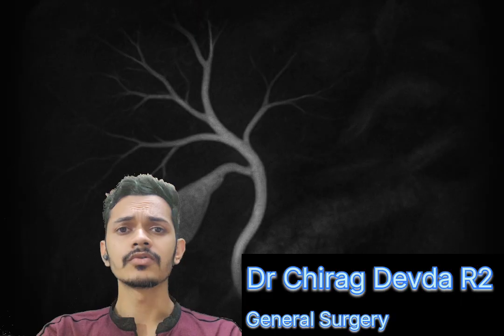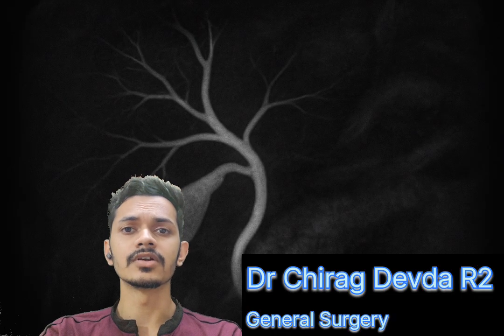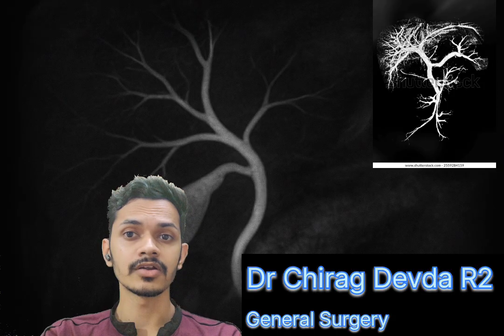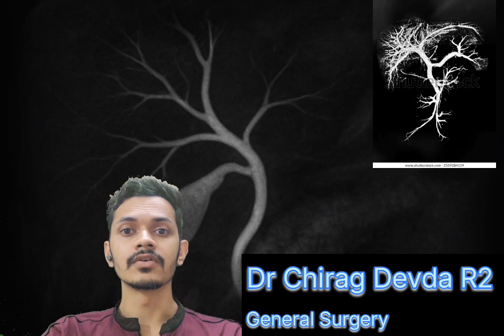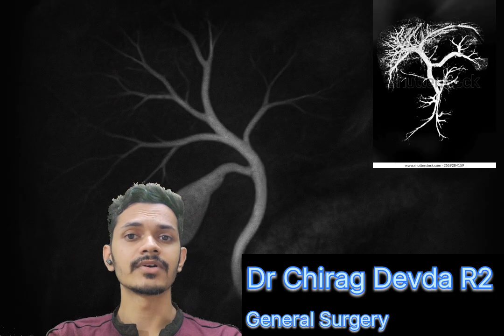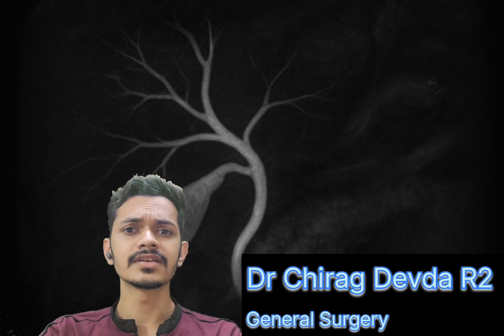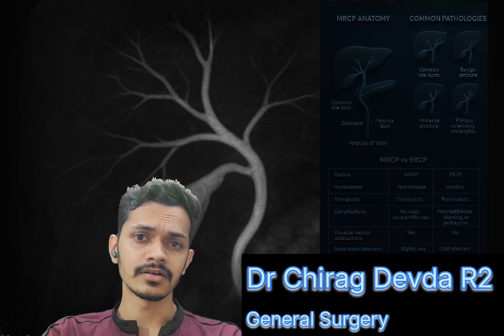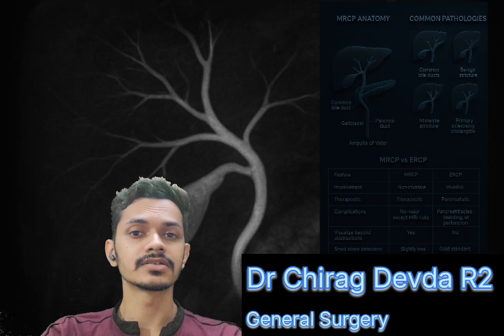Today we will learn about MRCP. MRCP's full form is magnetic resonance cholangiopancreatography. Today we will learn about this in detail. First is the definition. MRCP is a non-invasive MRI-based imaging technique that visualizes the biliary tree and pancreatic ductal system without the need for contrast injection into the duct.